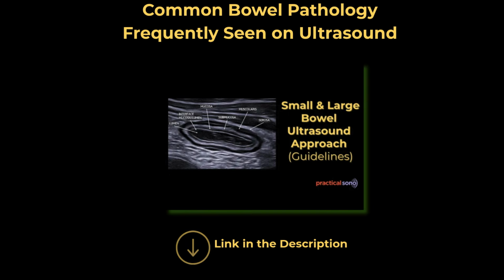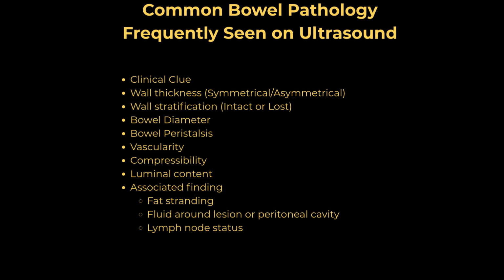Here, we will focus on the simple and important points of bowel pathology. Each pathology will be described based on these points. To make it simple and clear, only important points will be discussed.